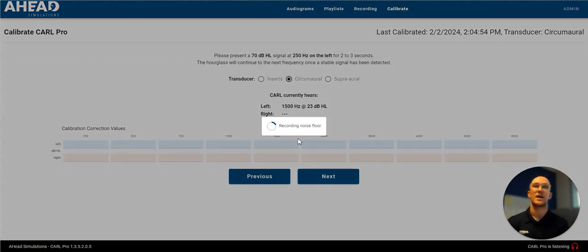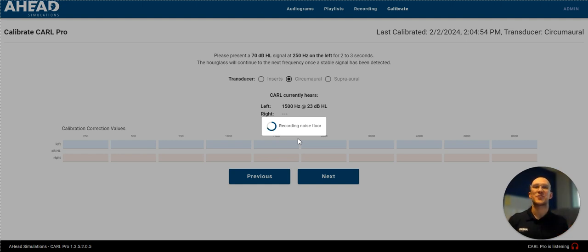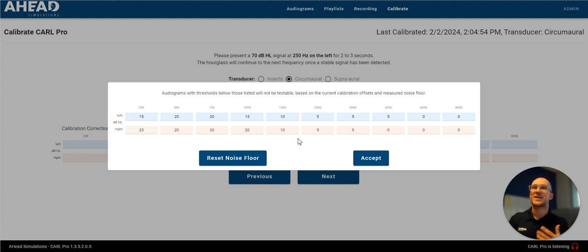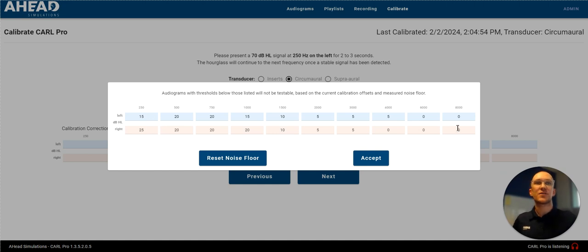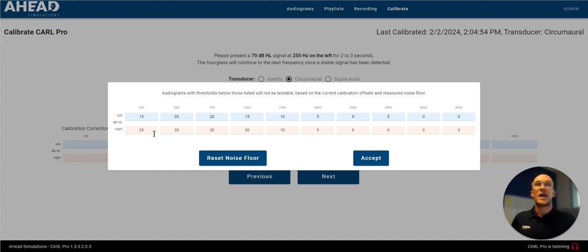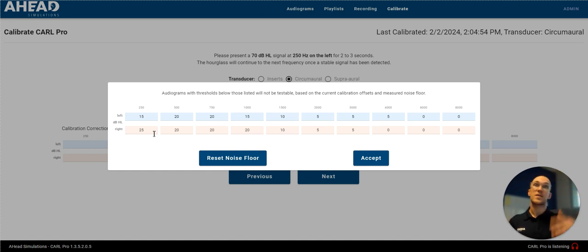I usually should not talk here, but you can see that it is recording the noise floor and most likely it's going to be a little bit louder because I was talking. So this is the graph that you see. You can see at every single frequency, it'll tell you what your noise floor was.